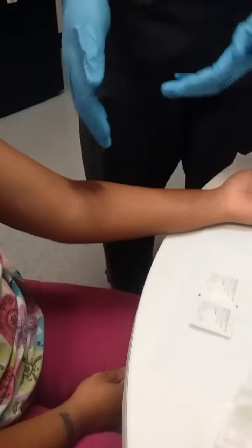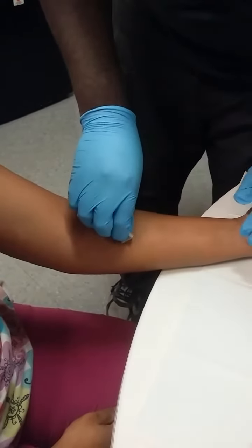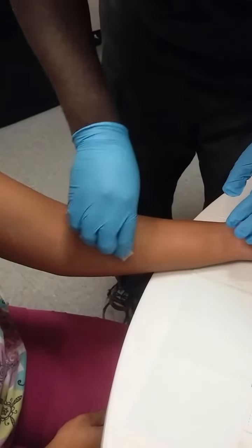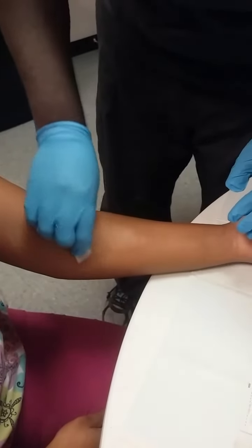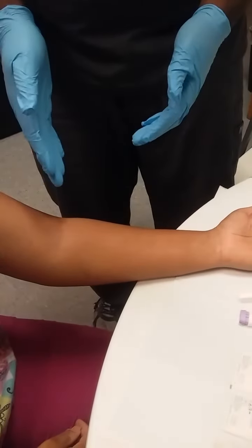Now that we've selected the incision site, we take our sterile alcohol pad out of the pack. We disinfect. We use small concentric circles going about 2 to 2.5 centimeters out. You don't want to go too far out, pretty much.